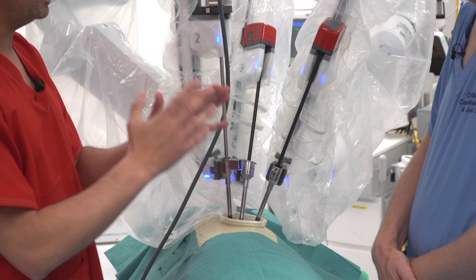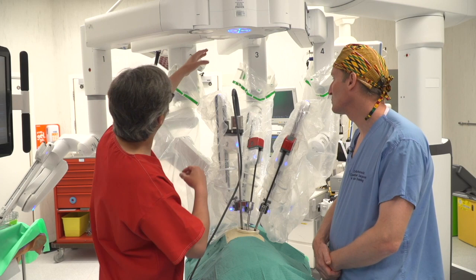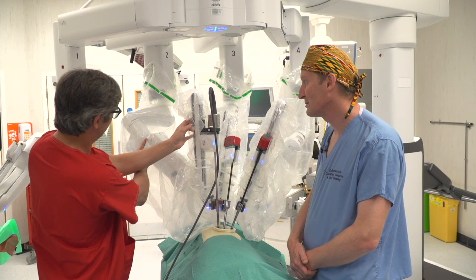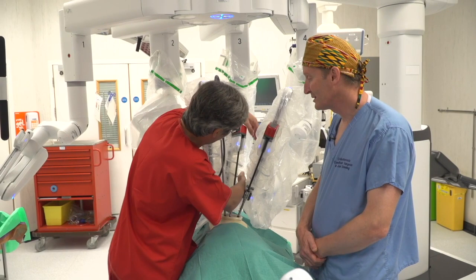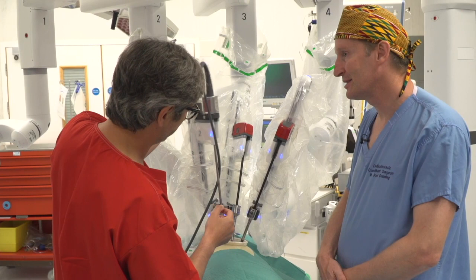The only thing is that the assistant should sometimes make a clearance here. If they see there should be a space here, normally one hand minimum, and not too much distance. The assistant here sometimes needs to change this, move the elbow, and do the clearance to avoid some kind of collision. But the assistant is always checking. He's checking the screen, he's checking the trocars. If he sees something, he moves it. Or sometimes he needs to move like this in some part, okay? If he sees that there is too much collision, he just changes.